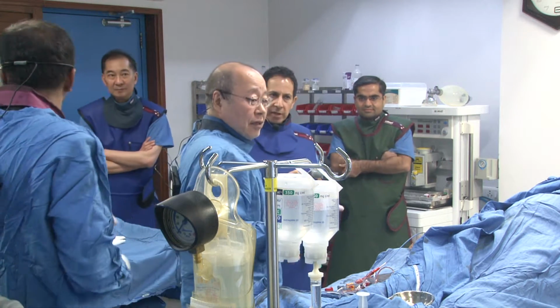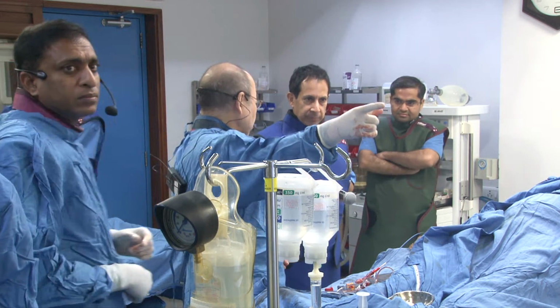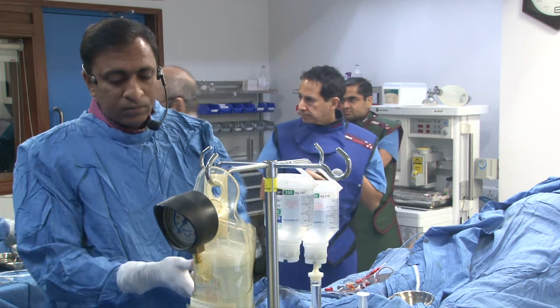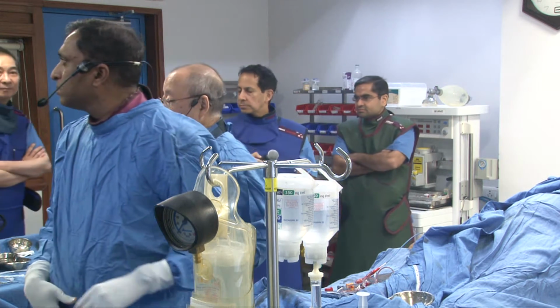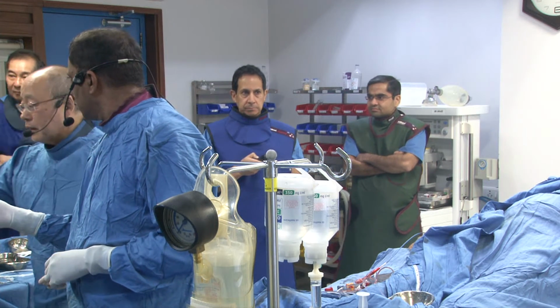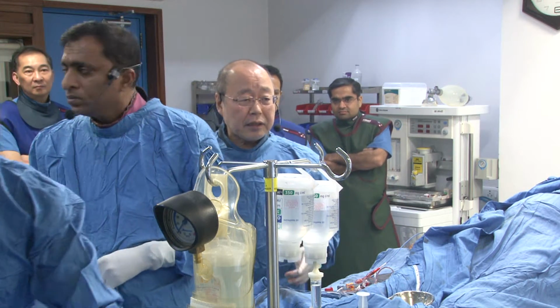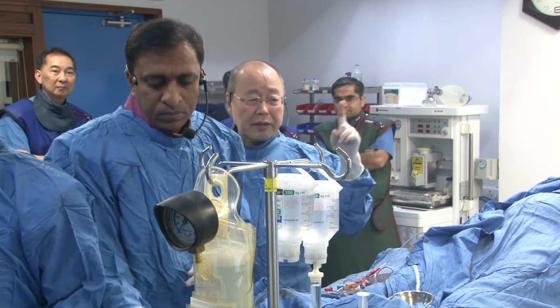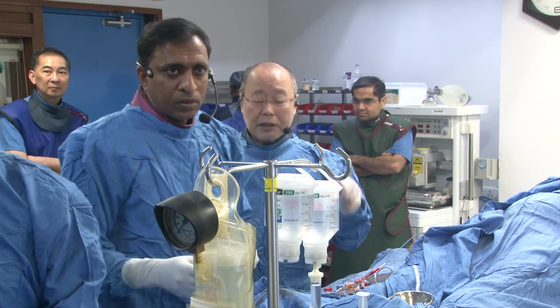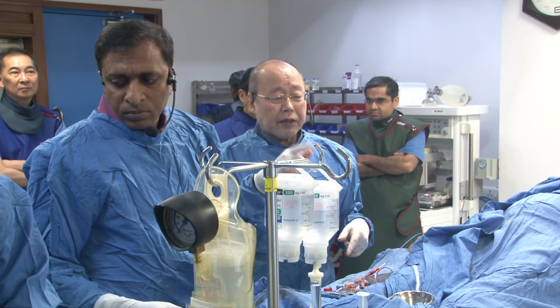Yes, I want to put the anchoring balloon to the first branch. Dr. Saito, do you hear us? Buenos dias. Do you want to take a plus catheter for better support in this case? Yes, I think in this case, that is one solution. But for this particular case, I will place the anchoring balloon to the first branch.